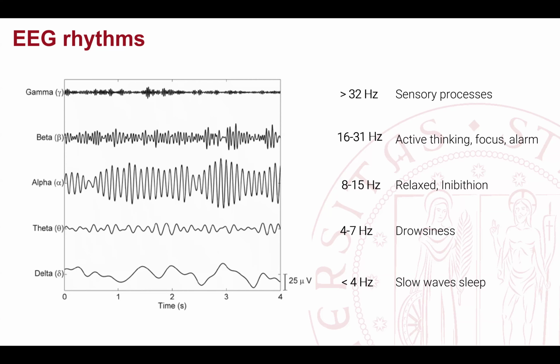You just said it depends whether it's 13 or 15. It depends on the individual? It depends on the person. So each person has their own alpha peak. I could have an alpha peak at 10 hertz. You could have it at 12 hertz. Someone else, something else. I will show you better in the slide, but still there is a peak covering a certain band, and this is exactly this band. But the peak itself can be shifted a little within this range.